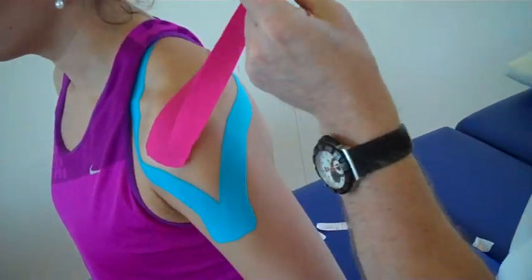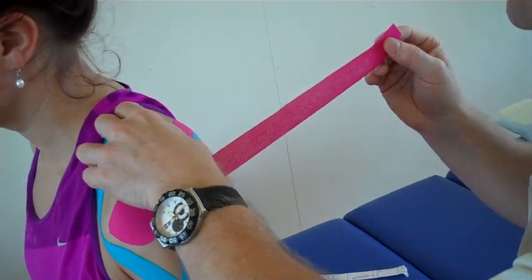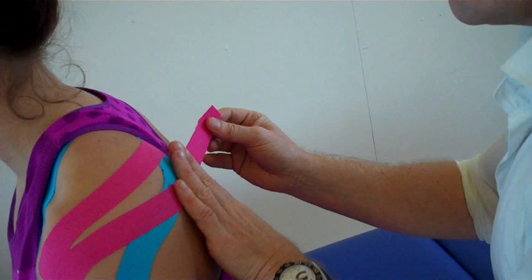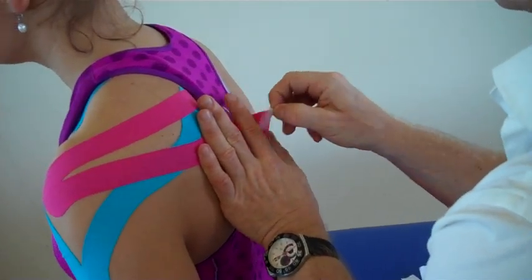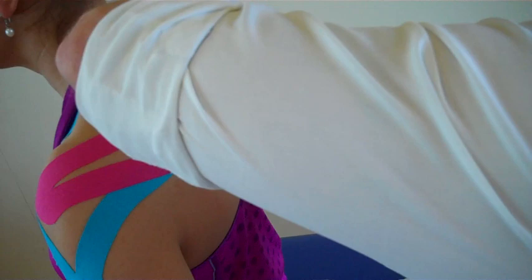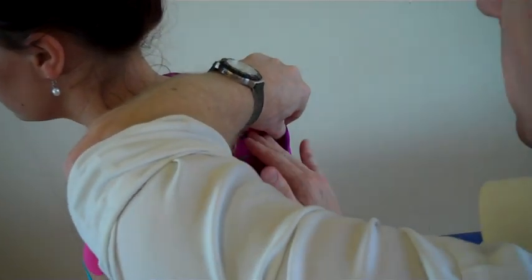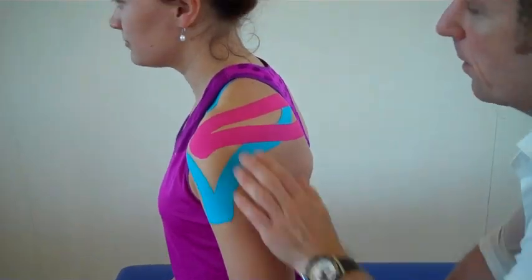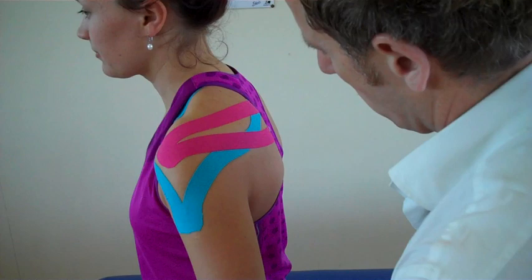For the second leg, bring it back to the end — remember there's no stretch on the ends — then 80% stretch. Spine of the scapula, go slightly below that. Feed that around and as I come round I'm just going to take this bit off. A little bit awkward with the top but we can just manage more nicely. Feed that around. Using the back of the tape or fingertips, we can just warm up the tape and relax your arm.